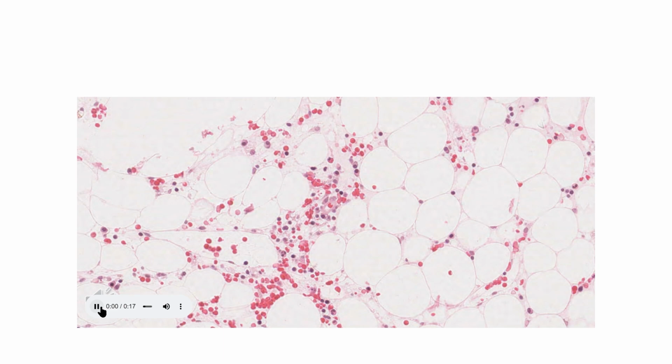At this magnification, you can barely make out the blood cells located in small pockets throughout the net. With higher magnification, you'll be able to appreciate the scattered red cells, plasma cells, some lymphocytes, and occasional neutrophils. What's missing from these slides are the megakaryocytes, the islands of erythroblasts, and younger granulocytes.